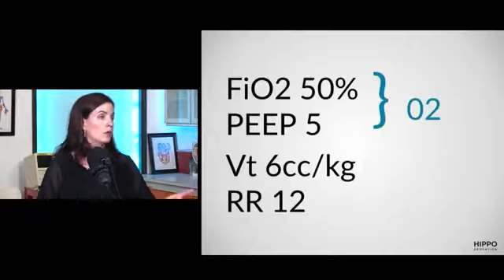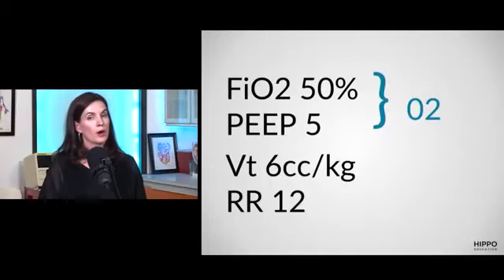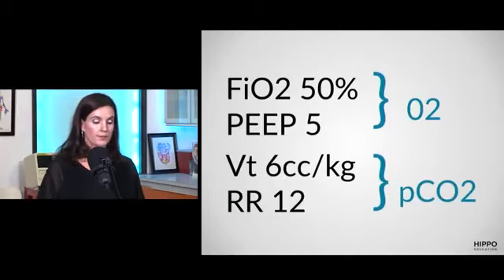Is there any time that you can go lower than that and keep it kind of safe if you're kind of stuck? Good question. So say your COPD person who might be a CO2 retainer, often we'll keep them at a SAT of 88 to 92. Okay. And that might be where they are at home and where they're happier. So thank you for flagging that. All right. Otherwise, for hypercarbia problems, we're titrating the tidal volume and their respiratory rate.